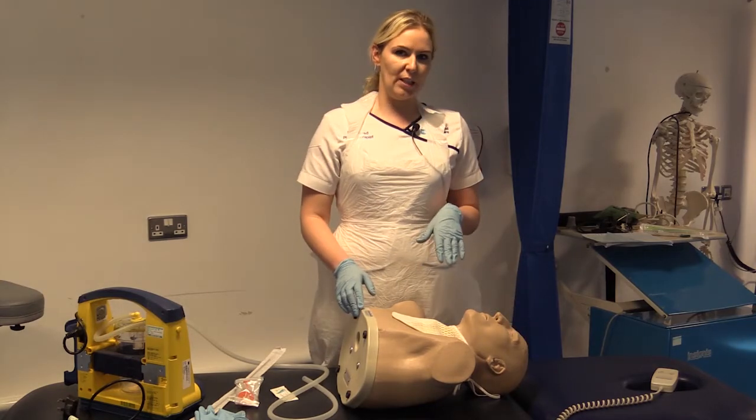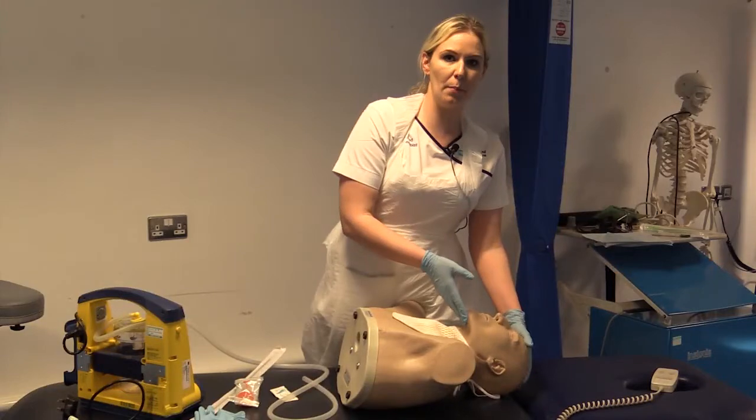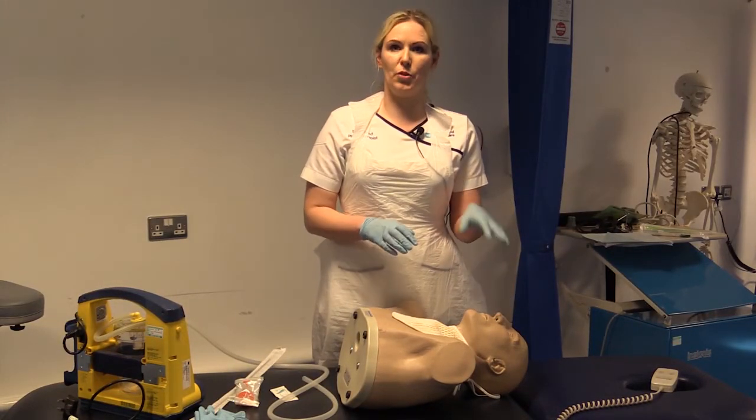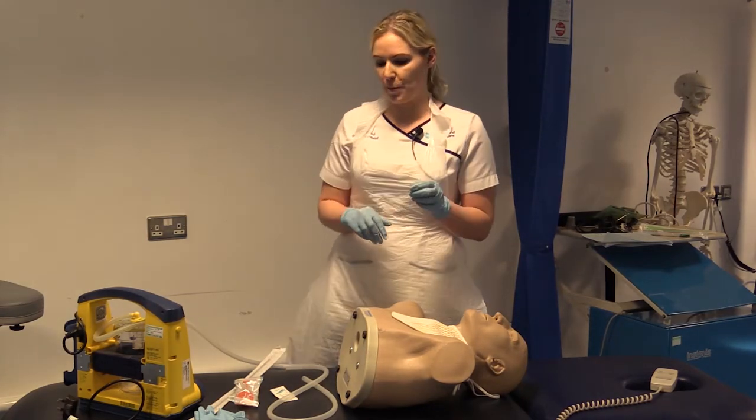You're going to position your patient again so their airway is as open as possible, ideally with the chin tilted up. You're going to pre-oxygenate for about 2 to 3 minutes before your suction, and just before your suction you're going to check your clinical obs just to make sure they're satisfactory before proceeding.